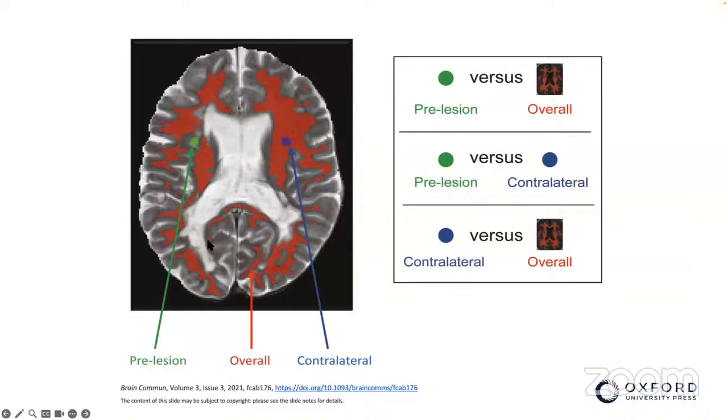I've picked this up from one of the studies that was able to confidently predict the site of normal appearing white matter where a lesion developed in the follow-up scans. So it is quite intuitive to think of normal appearing white matter as a predecessor, by a few months, by the way, to a subsequent active lesion.